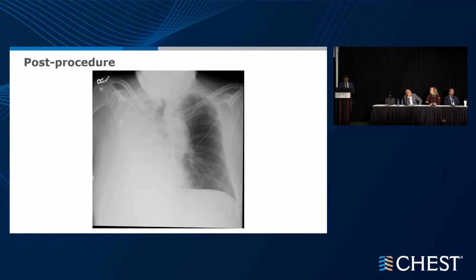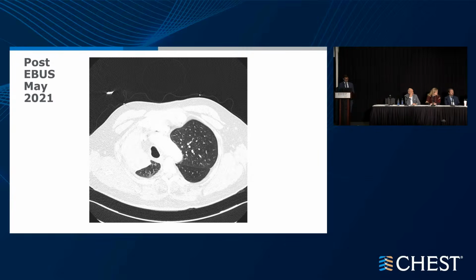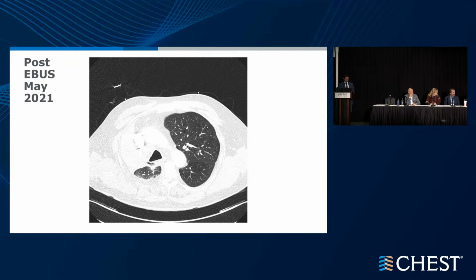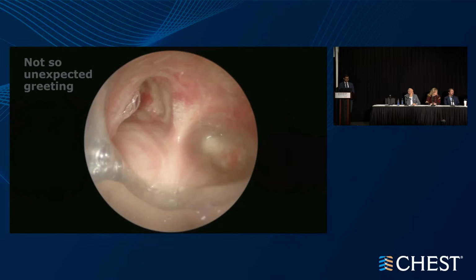What happened, my partner was in there trying to get biopsies, and EBUS and all that, this is what he ended up with. So post-procedure, I showed you the scout film pre-procedure, this is the post-procedure x-ray when he got to the ICU. And post-EBUS, the ICU team decided to get an x-ray and a CT at the same time. And so this is comparing April 2020 to now, post-procedure, a year later.